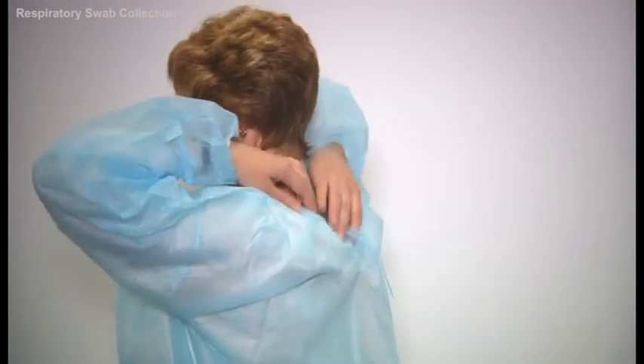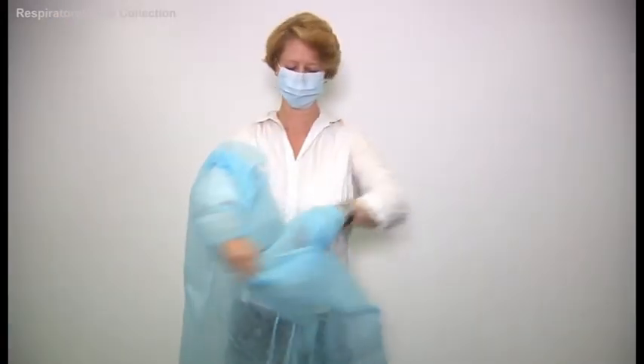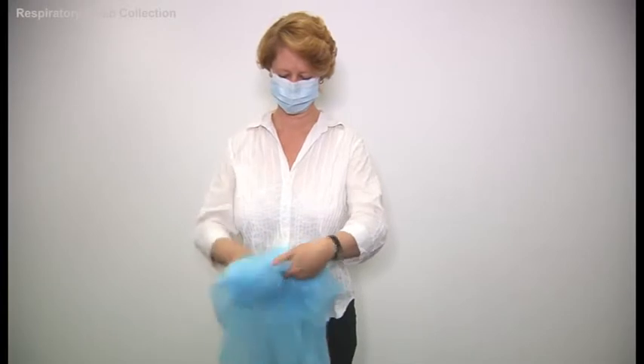Next, remove your gown. Remove the gown from the back or sides, avoiding touching the front of the gown. Fold the gown from the inside into a bundle. As before, avoid touching the outside of the gown.